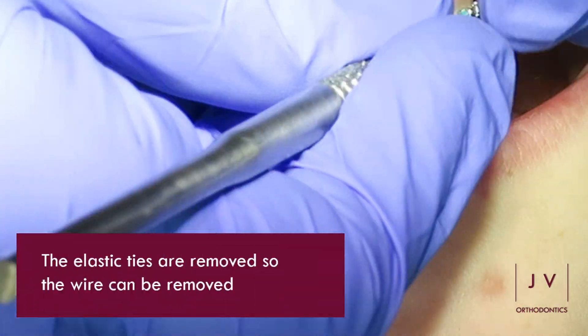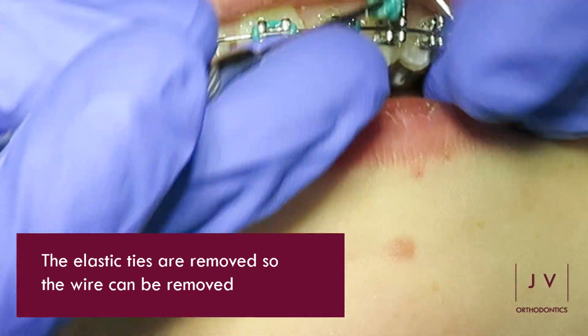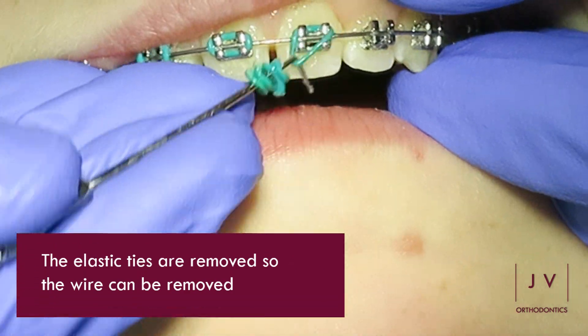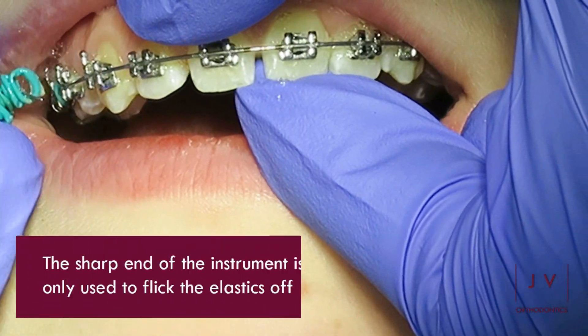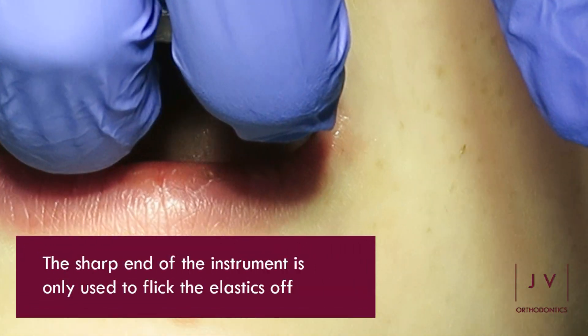The next step involves the elastic ties that we use to secure the wire. They are removed so that we can get access to getting the wire out. The sharp end of the instrument is only used to take the elastics off with.